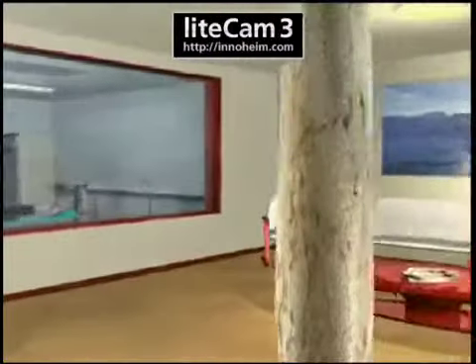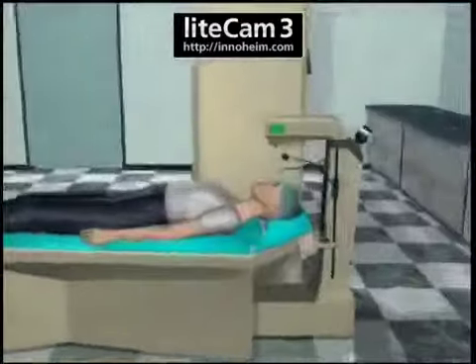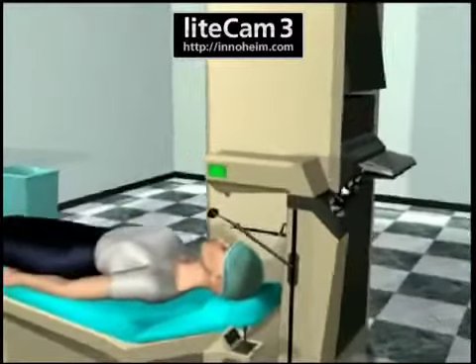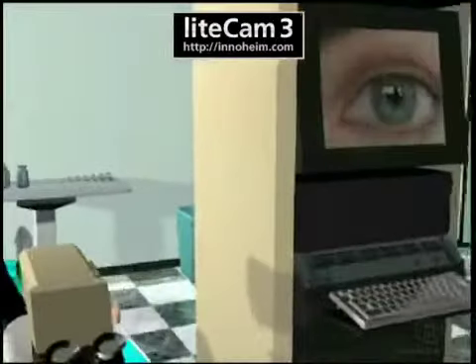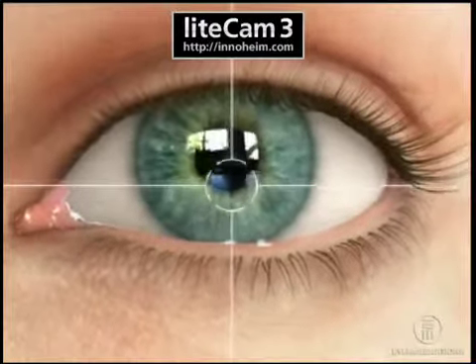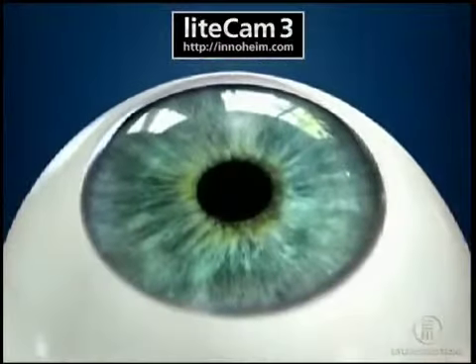Before the surgery, anesthetic drops are applied to numb the eye. The surgery begins with the patient entering the laser room and being put in a relaxed position on the surgical bed. The laser system is quite large and includes both a microscope and a computer screen. The surgeon will adjust the laser bed so the patient's eye is positioned directly underneath the laser, then use a special device to keep the eye from closing during the procedure.